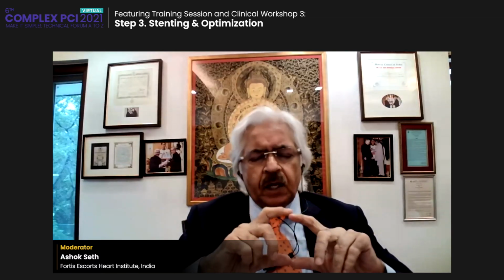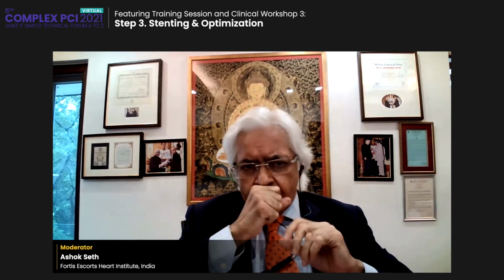I just want to slightly rephrase what you've said. Yes, every interventional cardiologist during the training stages must use imaging for almost all cases, so that they get a sense of the disparity of vessel size at angiography versus intravascular ultrasound. That is how it will translate into practice, at least for simple lesions, where if I see a 3 millimeter vessel angiographically, I will go anyway with a 3.25 or 3.5 balloon at moderately high pressures to get my final results.